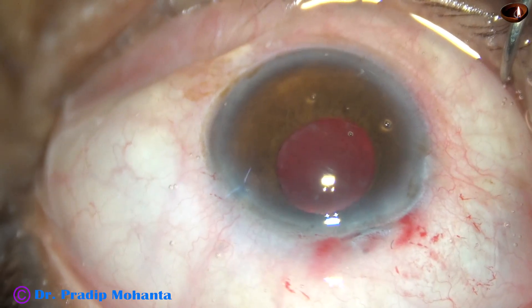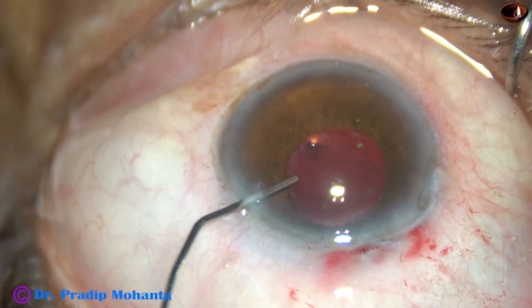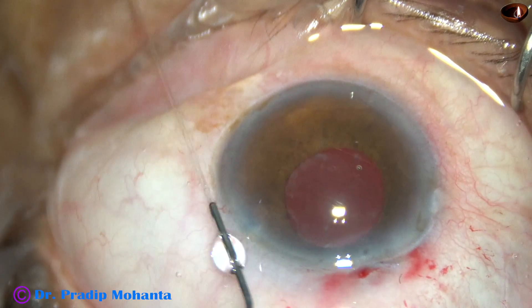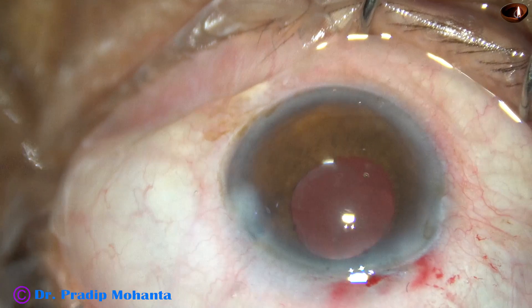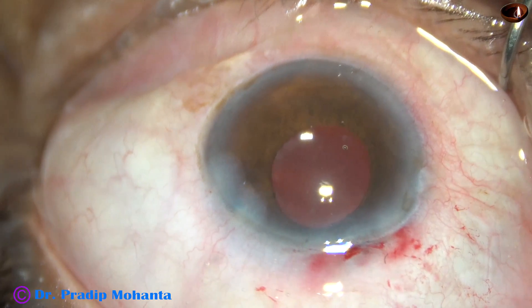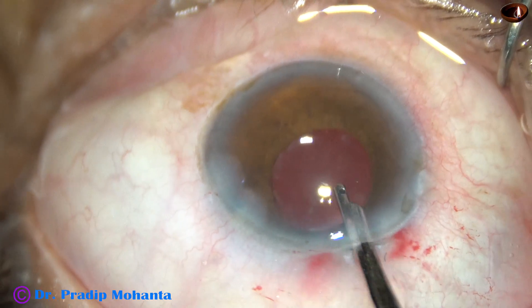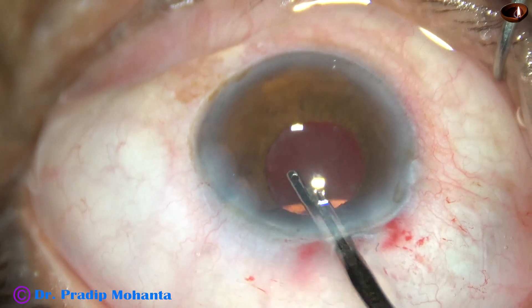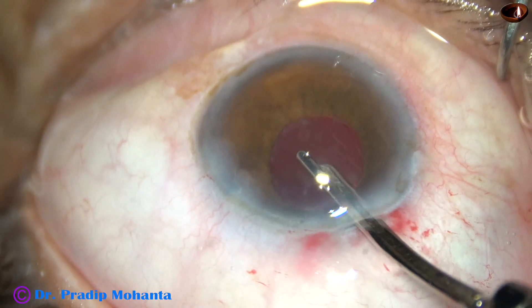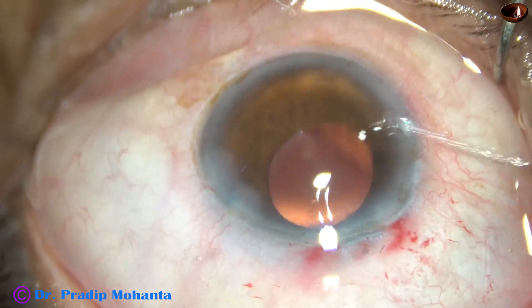In this case, the irrigation was through the main incision, and when the irrigation is through the main incision, lift the anterior lip of the main wound so that leakage becomes very minimal. And now the sideport is being hydrated. The main wound has been constructed in such a way that it doesn't need any hydration. And this is the final lavage of the anterior chamber. The anterior chamber is nicely formed and the case is concluded.